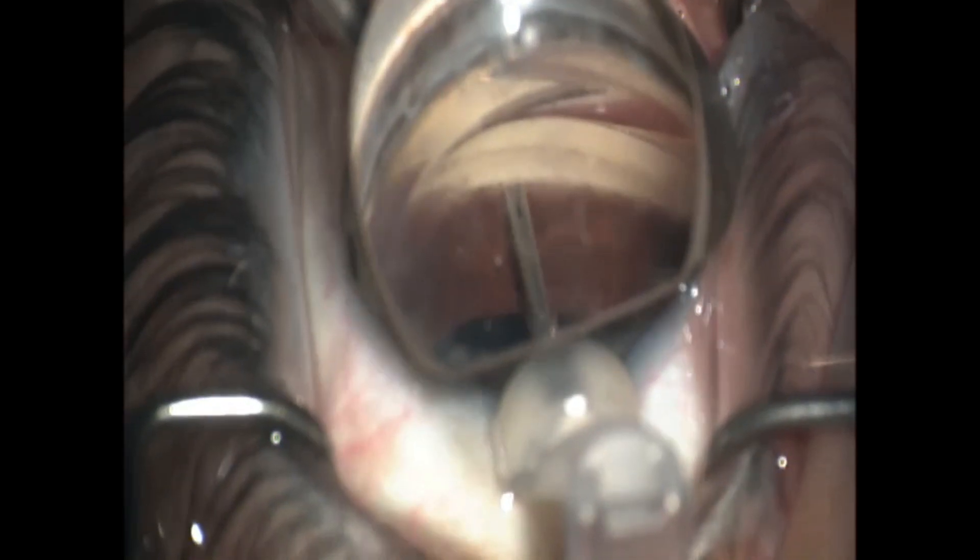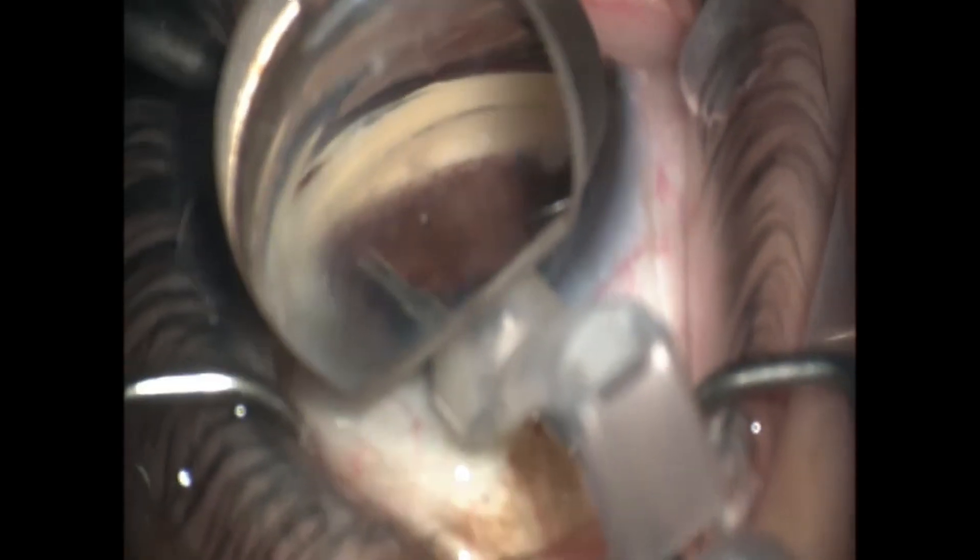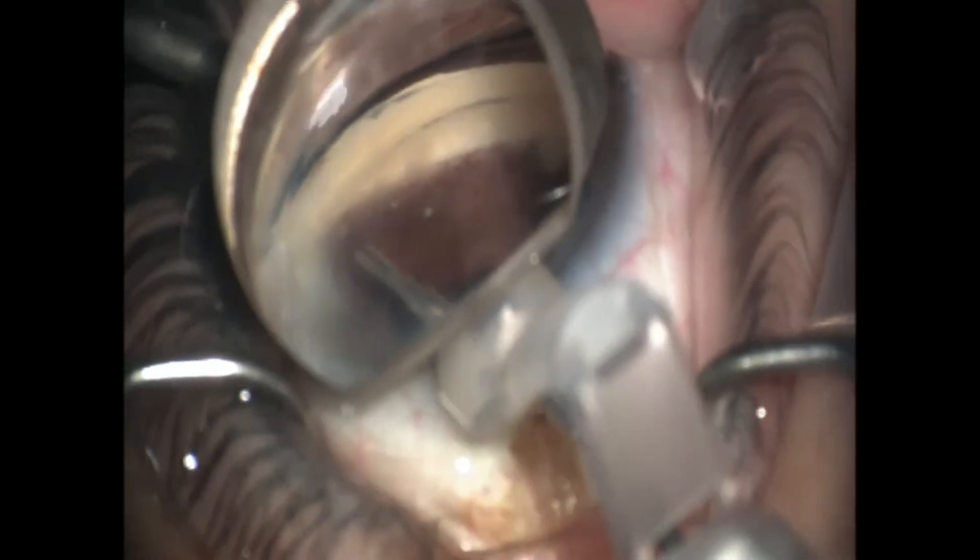Just by placing it inside of the eye, it pulls that trocar into view. Keep in mind, these new iStent Infinites run off of the same trocar as the new injectors, where the tip of that trocar is a little bit shorter than the classical iStent inject wide. So you do have to push slightly harder if you're noticing that your stents aren't going directly into the trabecular meshwork on the first go.